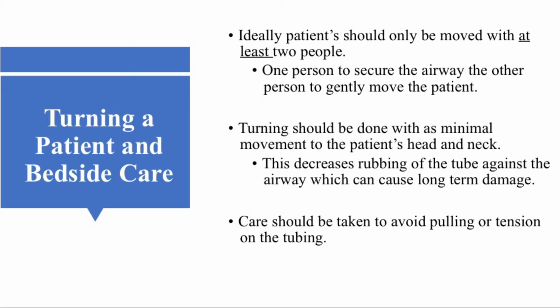Turning a patient and bedside cares. Ideally, patients should only be moved with at least 2 people. More than 2 people may be necessary depending on the patient's size and severity of illness. One person should be used to secure the airway and the other person to gently move the patient.